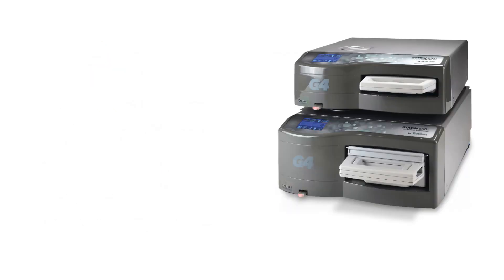This video will explain the details of installing, operating, and maintaining your STATUM G4 unit. For additional information, please consult your operator's manual.